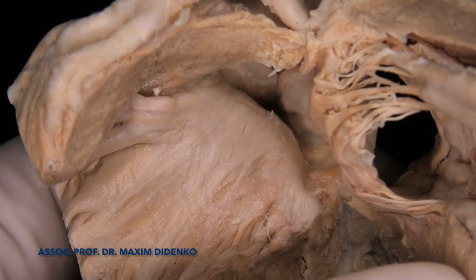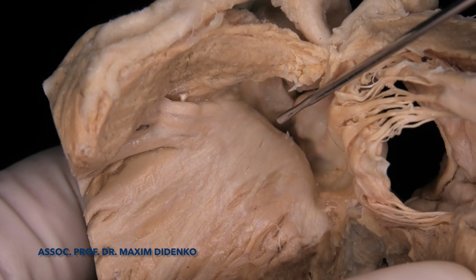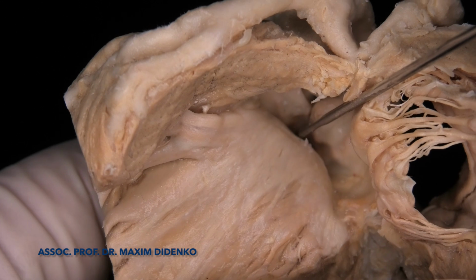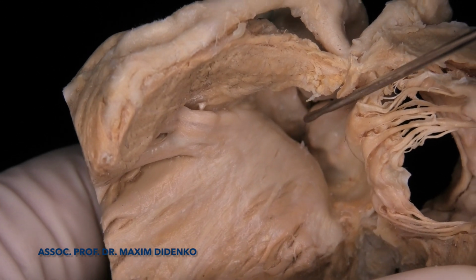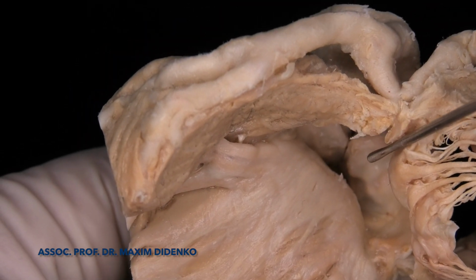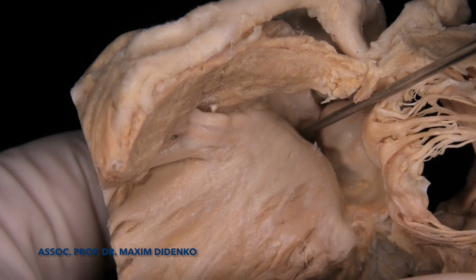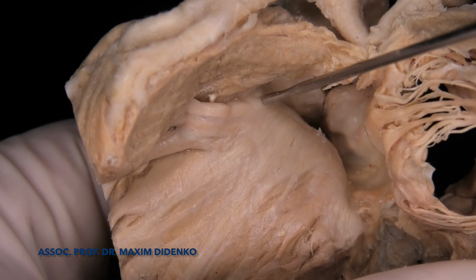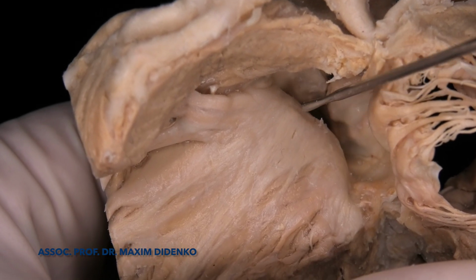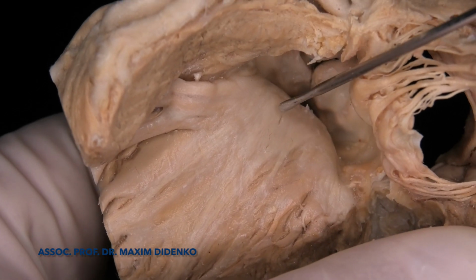If we take a more careful look at the left bundle, from this view we can see that it comes from the area of the membranous septum, which is located between the right sinus of Valsalva and the non-coronary sinus of Valsalva, and it comes with a very wide area. This is the proximal part of the left bundle branch, and then it divides into several fascicles.